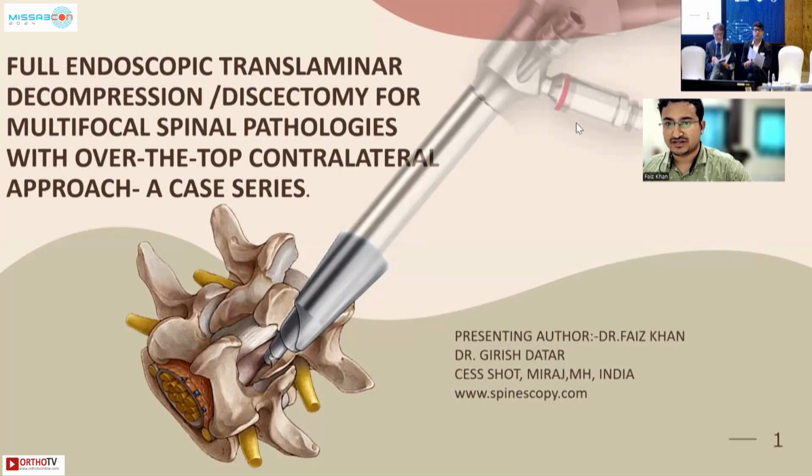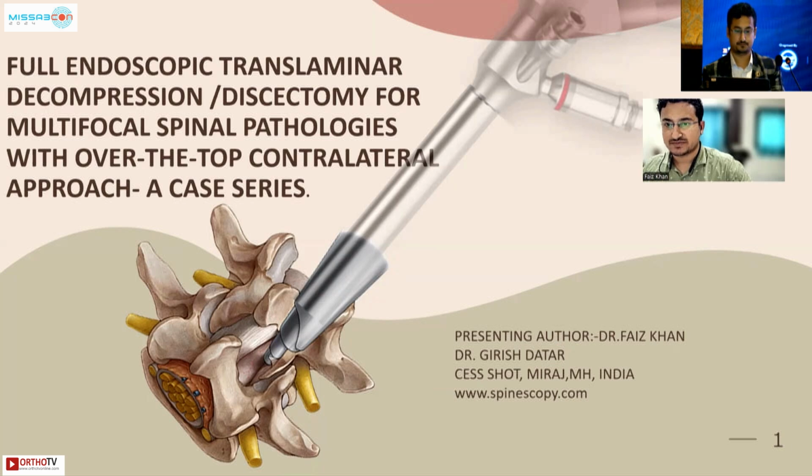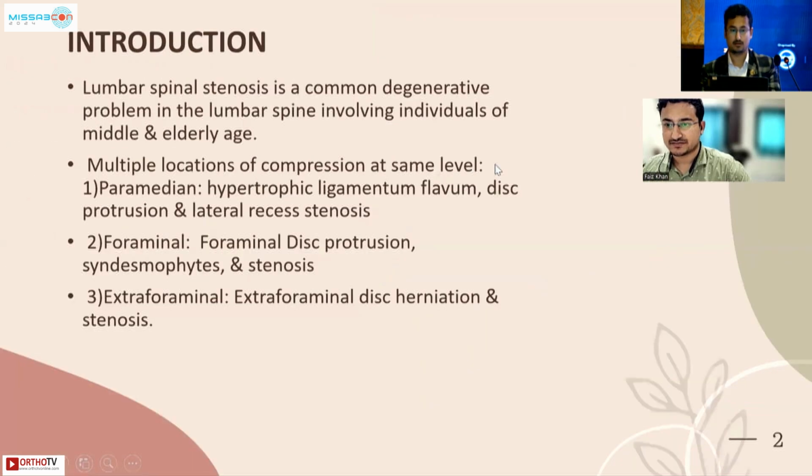Full endoscopic translaminar decompression or discectomy for multifocal spinal pathologies with over-the-top contralateral approach, a case series. Lumbar spinal stenosis is a common degenerative problem in the lumbar spine involving individuals of middle and elderly age. Multiple locations of compressions at the same level are present.